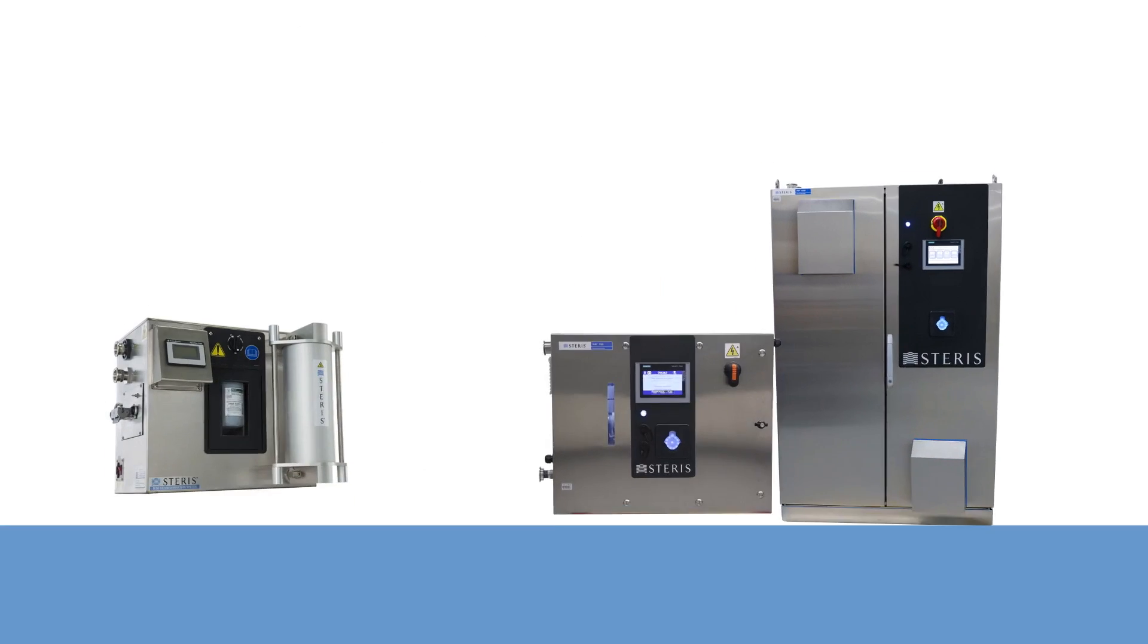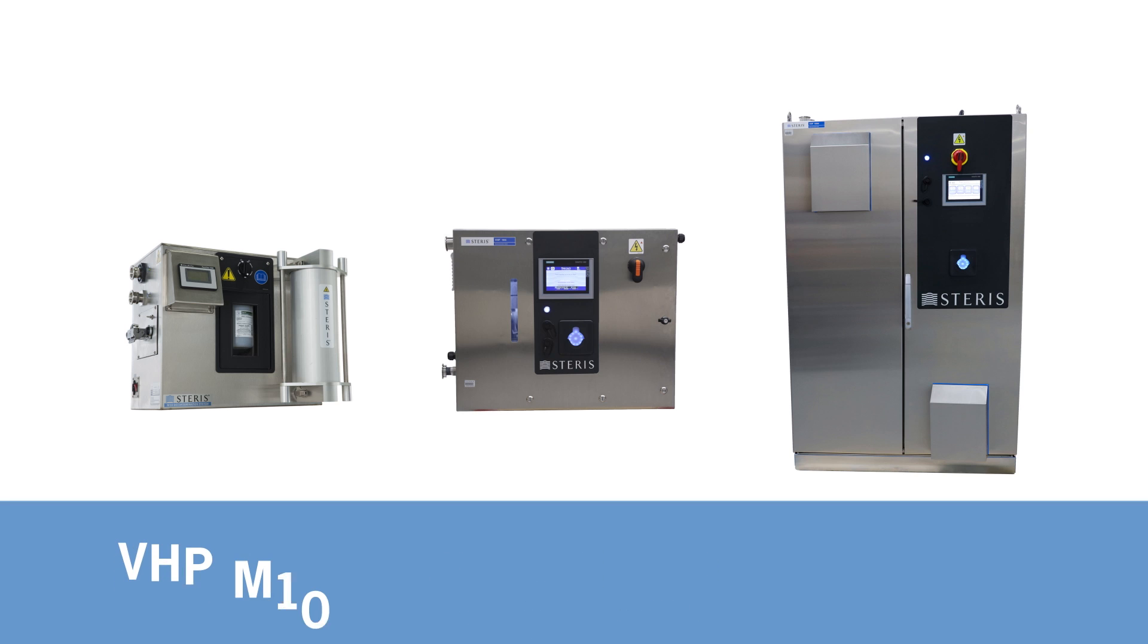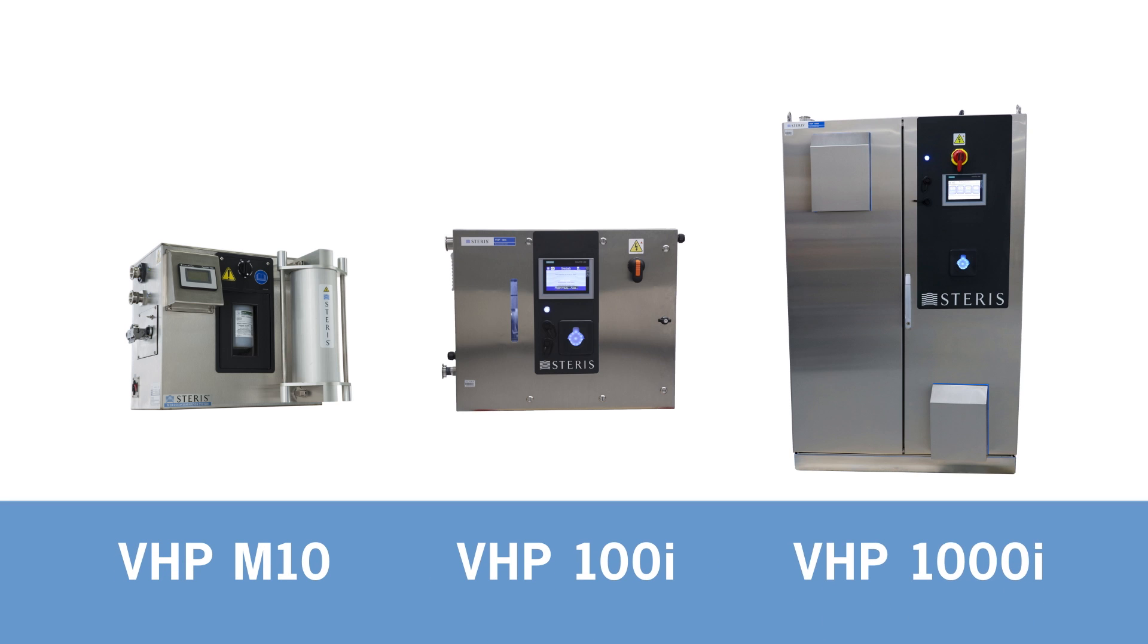Steris offers a variety of equipment options to meet your facility needs, from small 1-cubic-meter transfer chambers to large 1,000-cubic-meter spaces.